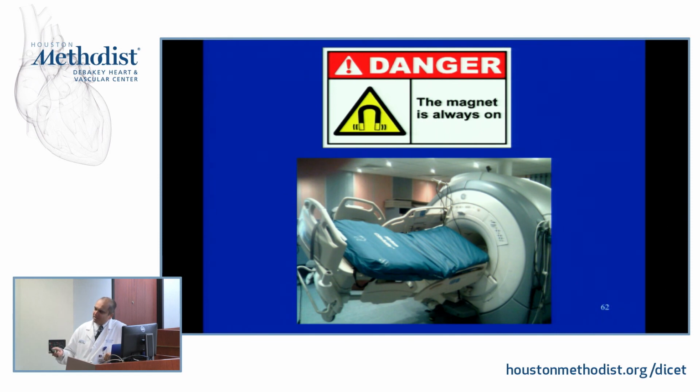The first, obviously, is that when we talk about a magnetic field that's 20,000 times stronger than the Earth's magnetic field, it's actually a very powerful magnet. And that means that if you take a ferromagnetic object, it will start to get attracted to the magnet, and it accelerates as it gets closer because the magnetic field gets stronger as you get closer to the magnet, right? So this is an example of what can go wrong. You could accidentally take a bed or an oxygen tank or something into the room that's magnetic, and you could cause a disaster. If a patient was lying on the board here, we'd have a major, major problem, right?